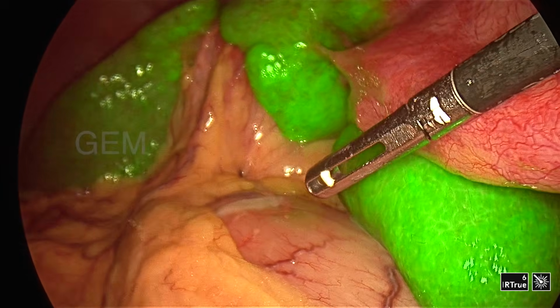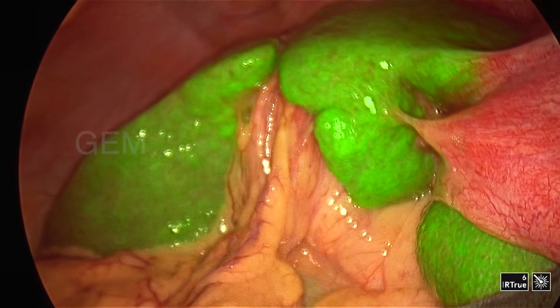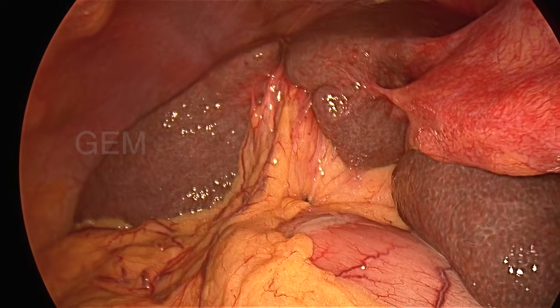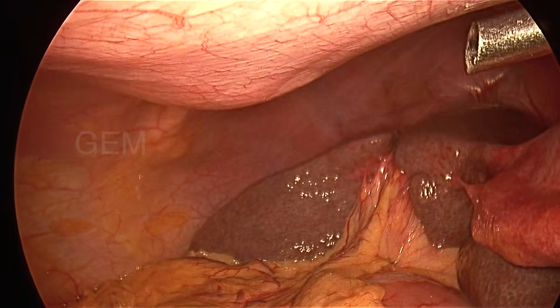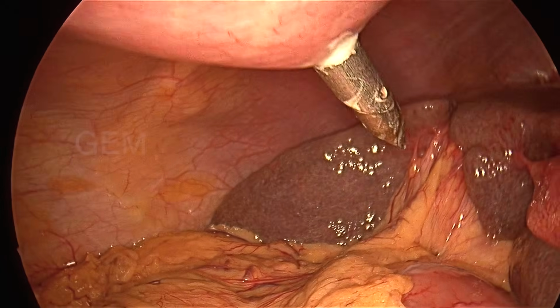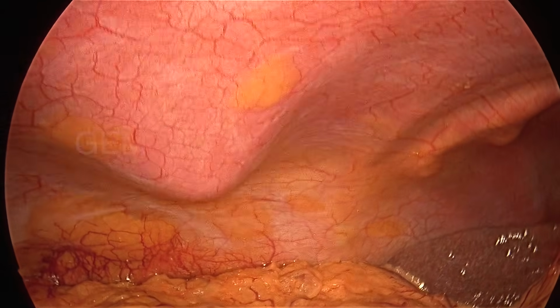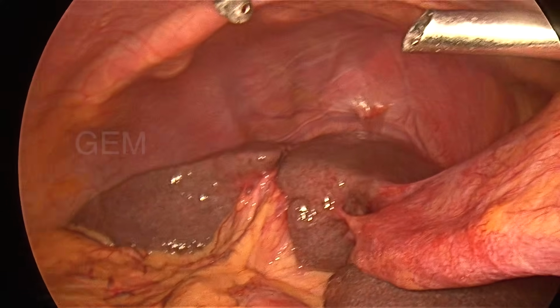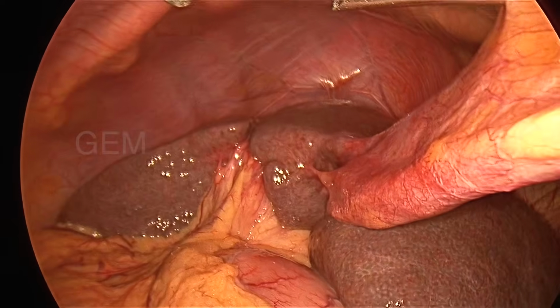And I gave ICG on the previous day, and you can see only the liver is getting highlighted, and no blood vessel is highlighted when you are viewing it in IR mode. So I am making a 5 mm port in the right subcostal, and then a right lateral port for retraction of the gallbladder. All the ports are placed towards the gallbladder, as you can see now, so that postoperative pain at the port site will not be there.